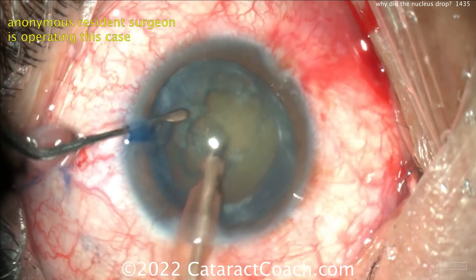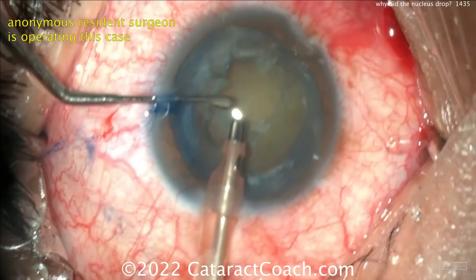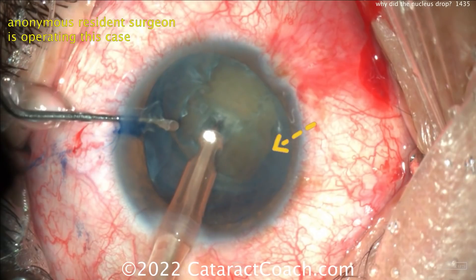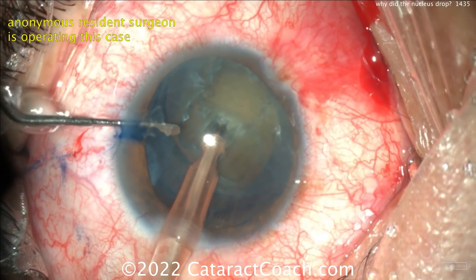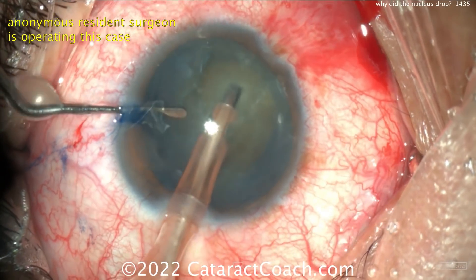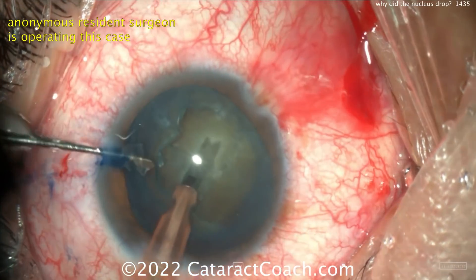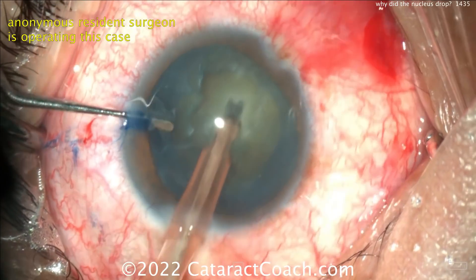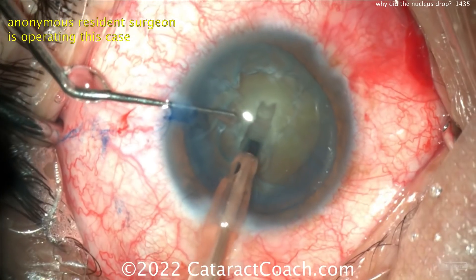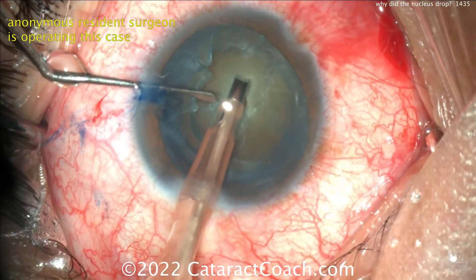With this density of nucleus, you want to be able to make a groove, but use enough phaco energy so that the nucleus itself stays still and doesn't move around. You'll see the groove going down in the middle. With a denser nucleus, if you're not using more power, you need to do shallower passes. Think of it like scooping really hard, deeply frozen ice cream — if you try to scoop too deeply, you bend the spoon. Make each pass shallower. This groove needs to be longer and less deep.